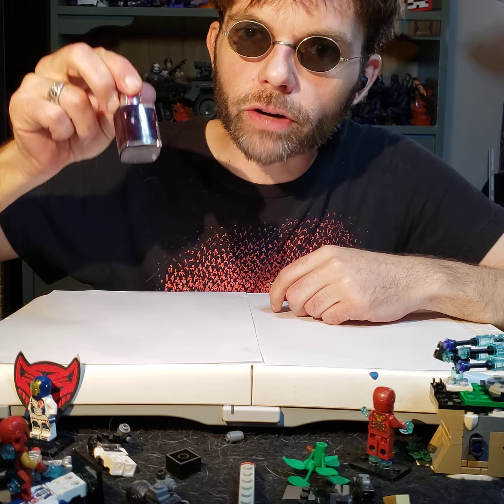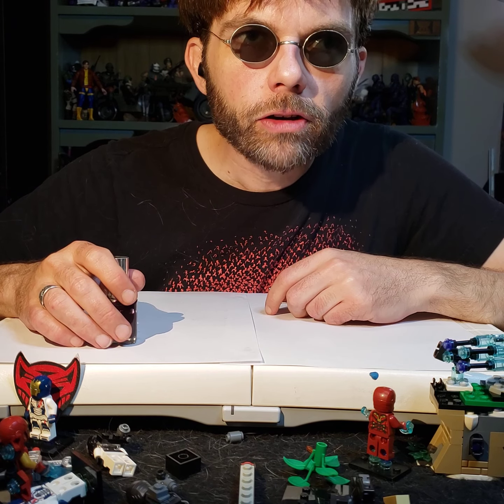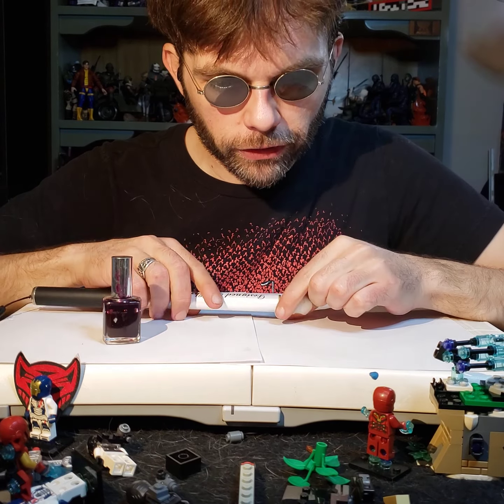And she found me this red nail polish that I've had for almost a decade now because I never use it except occasionally. And today we're going to use it to repair a blind cane. I've got this blind cane here, the blind cane that I've actually done a video on.